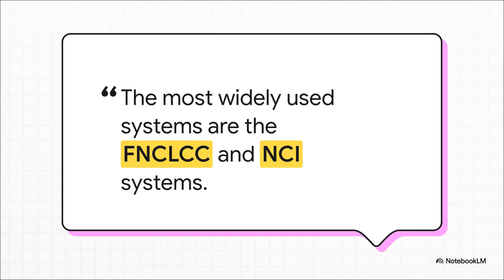Well, the CAP protocol points us to a very specific, standardized method, the FNCLCC system. This is the gold standard because it's reproducible and does a fantastic job of predicting patient outcomes, all just by scoring 3 key features under the microscope.